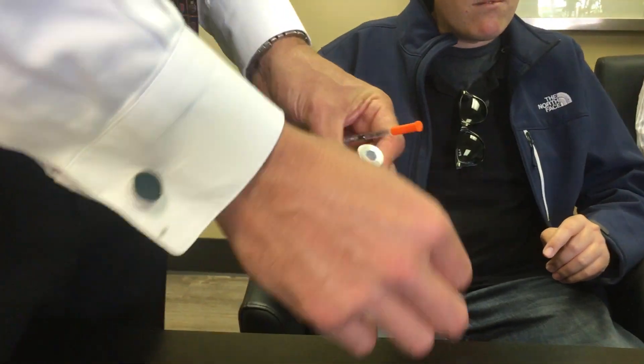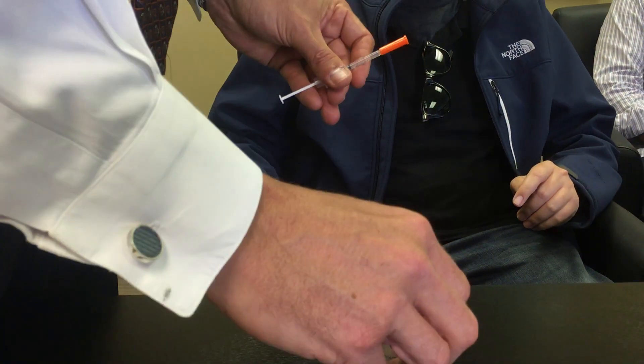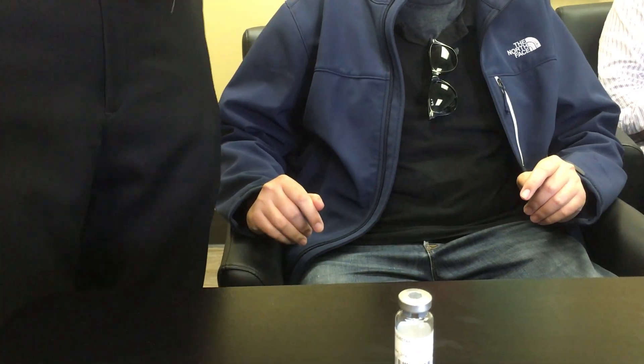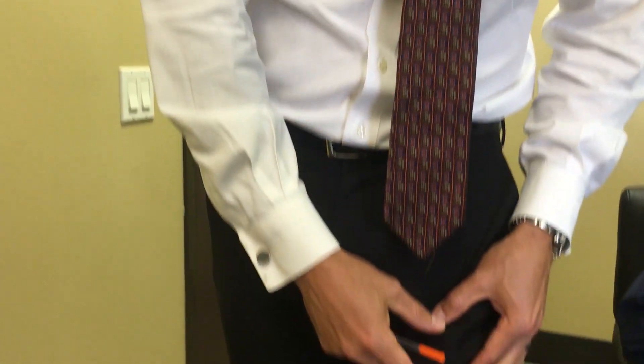Before you inject, always take an alcohol pad and wipe off the top of the bottle to sterilize it. You can inject in two places: anywhere in the abdomen, or mid-thigh.